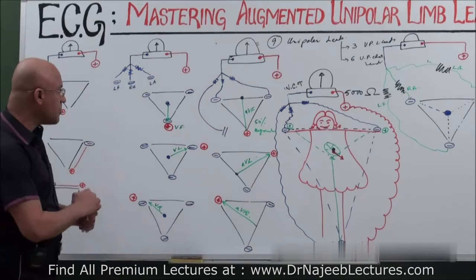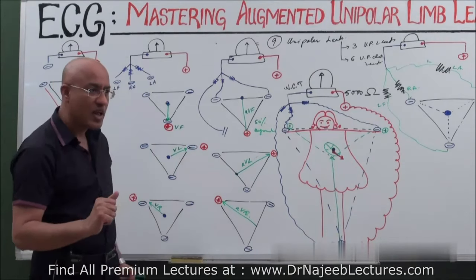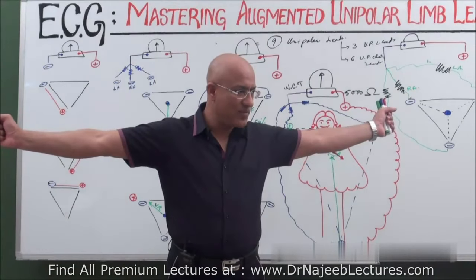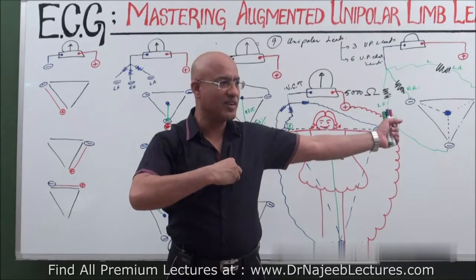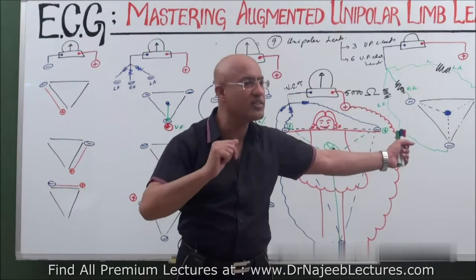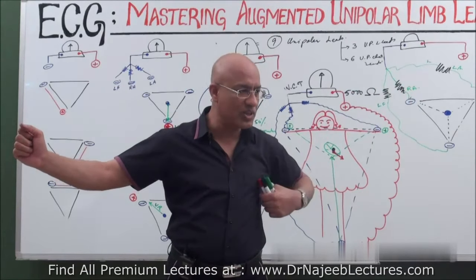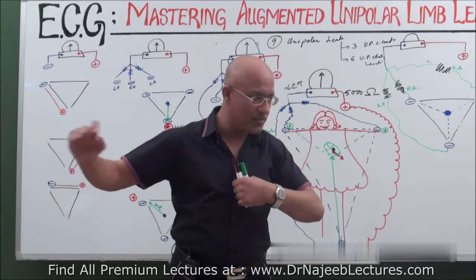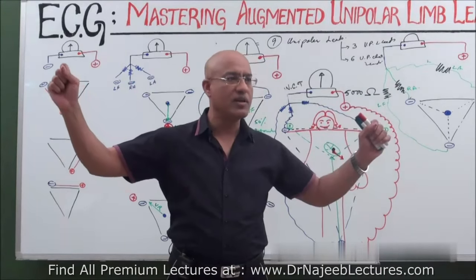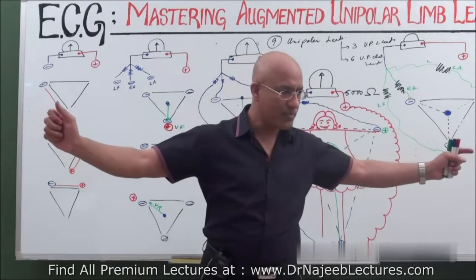The reason being, in the limb, wherever you put positive, there is also negative there, and part of the voltage is cancelled. But if you put, listen, negative here, and negative here, and the positive electrode you are putting on the chest, do you think the voltage will be neutralized? No. If you are making a chest lead by the Wilson central terminal, then the positive electrode you are putting on the chest, at different positions, the movable chest lead electrode, right? But the negative electrode, when you are making the chest lead, is applied on the right arm, left arm, and the foot.